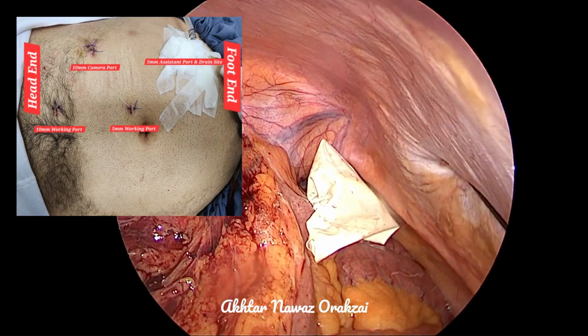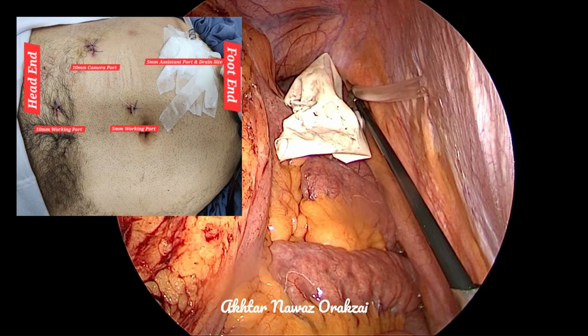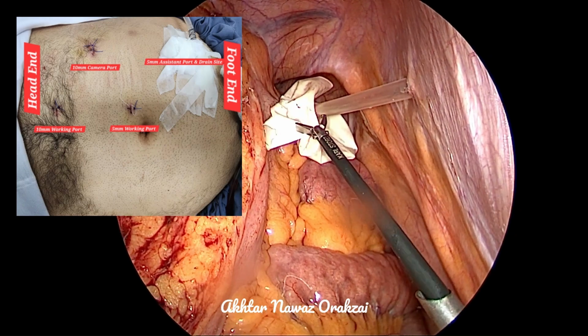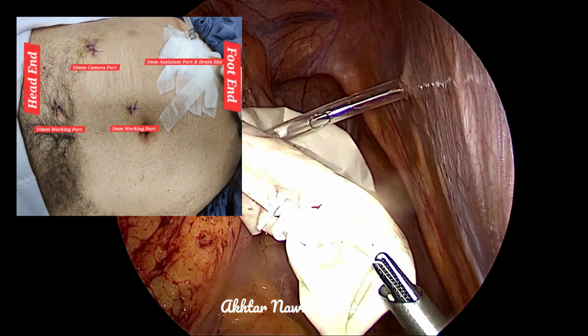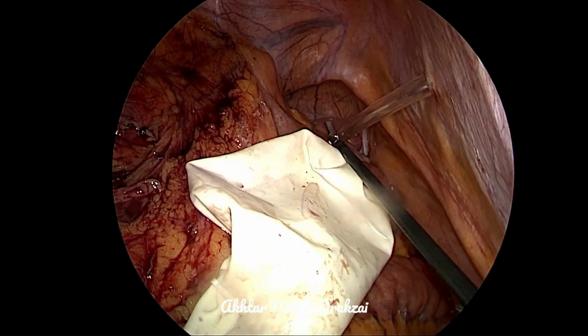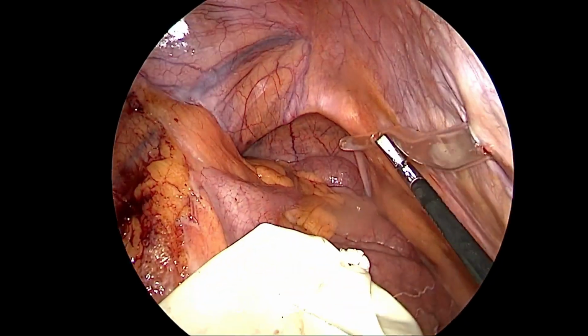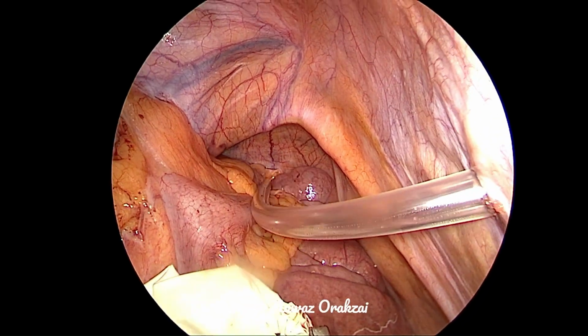So we placed the drain, and the drain should be placed in the pelvis. You can see in the offset the camera port. We removed the stones through the camera port. They were quite easily removed one by one. So the drain is placed in the pelvis.